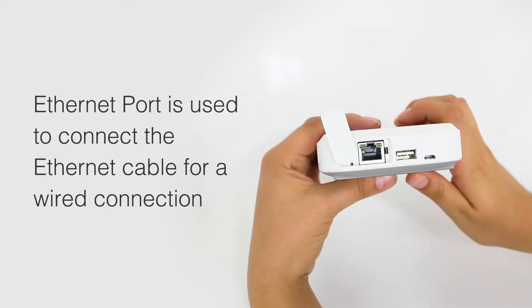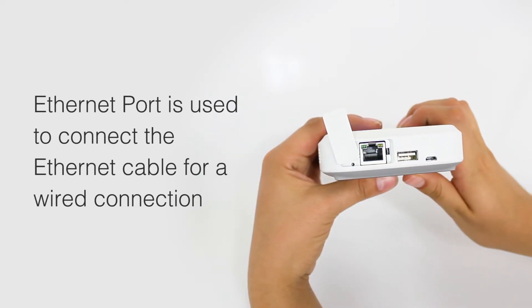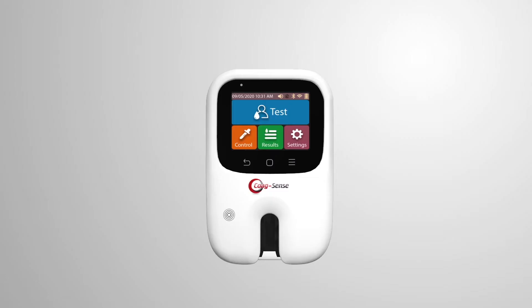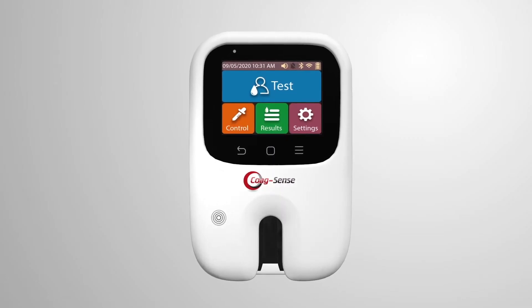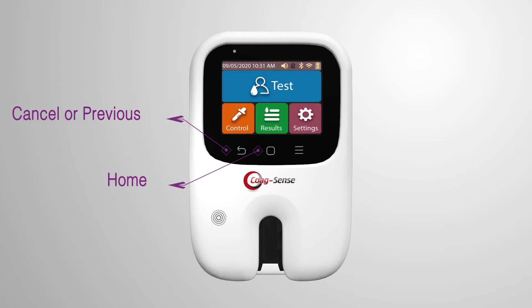This port is provided with a port cover. There are three touch buttons: cancel or previous screen button, home screen button, and view menu button.